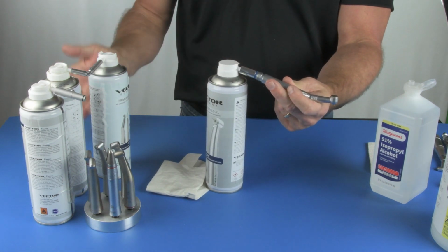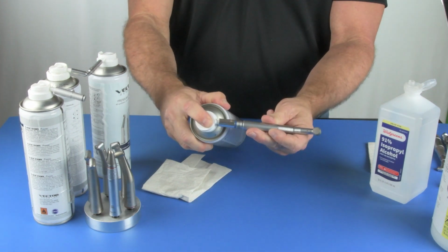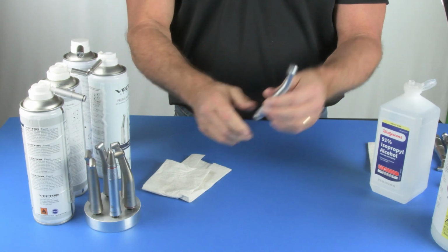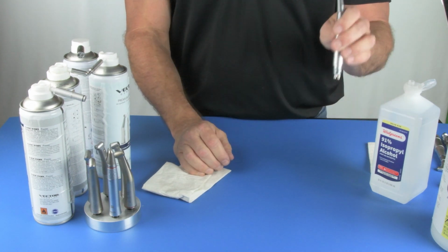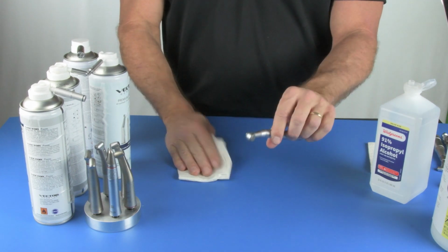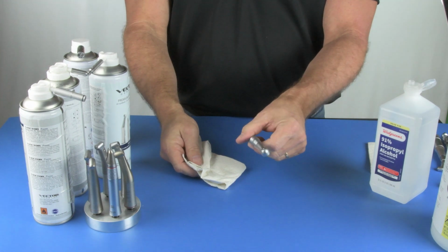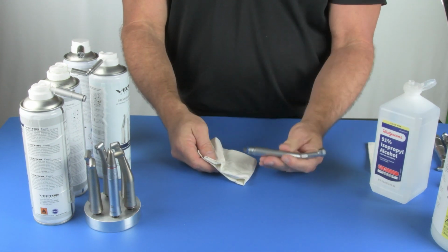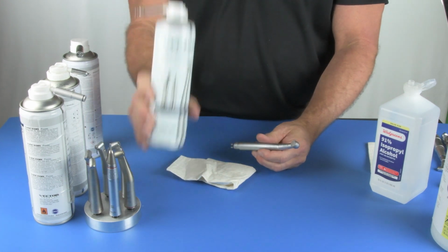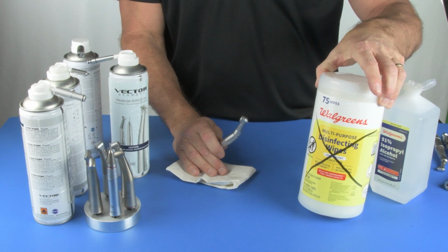You'll follow the same as the initial handpiece with a quick disconnect. Go ahead and spray for 2 seconds. Take the handpiece into the operatory or onto a quick air station. Blow the handpiece out for 10 seconds. Come back in the sterilization room. Wipe the handpiece with an alcohol damp 2x2 to remove 99% of the oil and sterilize the handpiece. When the handpiece comes out, you do not need to relubricate if you're using this oil. You do not want to use any type of other disinfectants or anything else on these handpieces either.